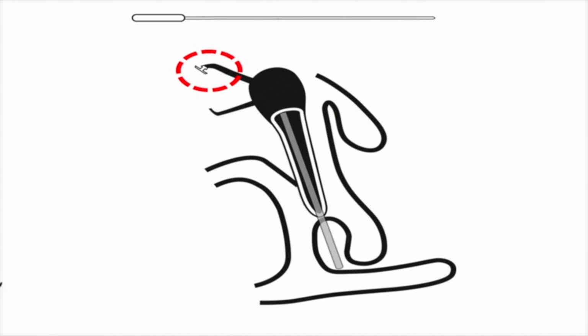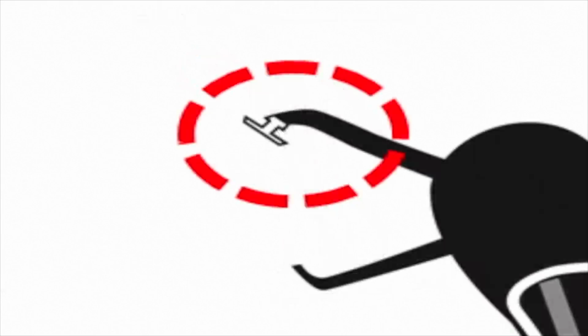Fourth, once the insertion guide has been fully withdrawn, the fixation head should not show any signs of becoming buried. If there is a tendency for the MASTERKA to become buried, it should be removed. If the punctum remains too dilated to secure the fixation head, then the MASTERKA should be removed and inserted in the opposite canaliculus where it may more securely hold in place.